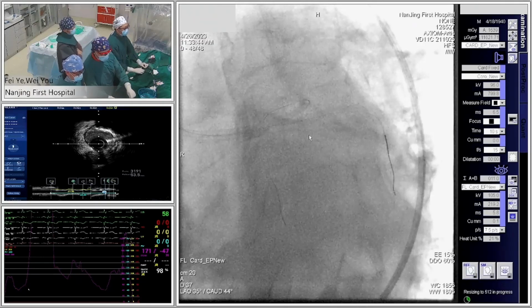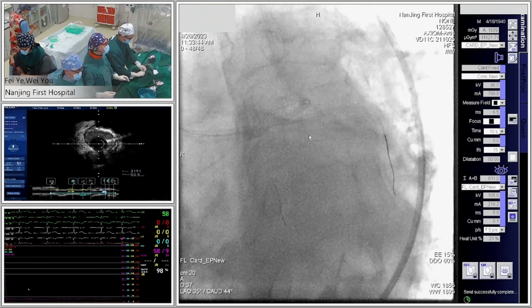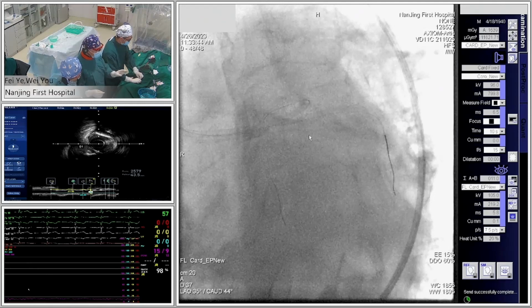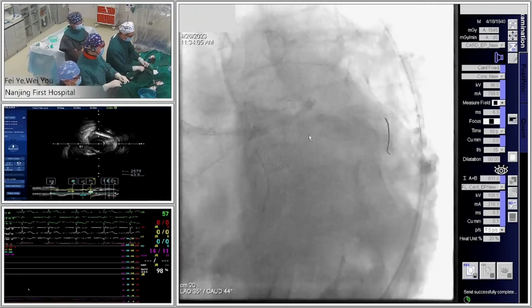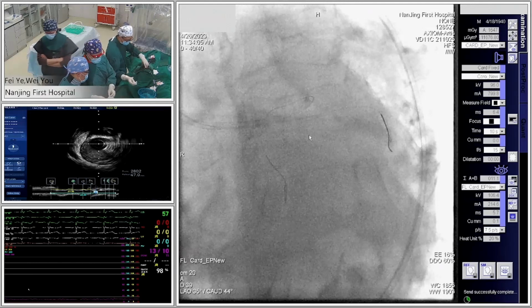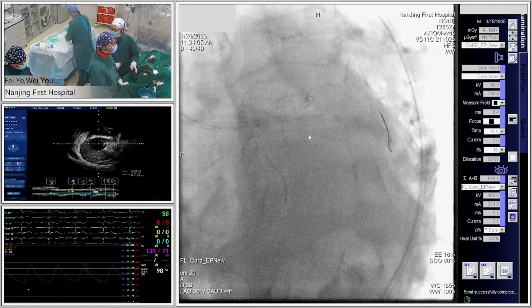Chief, do we need to check IVUS to confirm the crush stent? Based on the IVUS, we can see the proximal reference was 4. Need a short balloon. Give me the POT balloon, please. We have a POT balloon, very interesting. It's very useful to perform a precise crush.